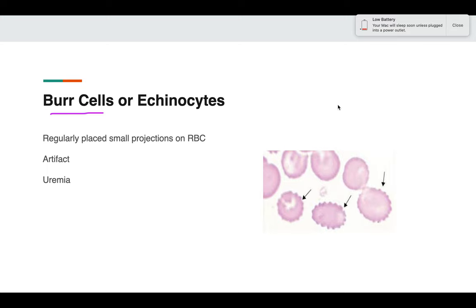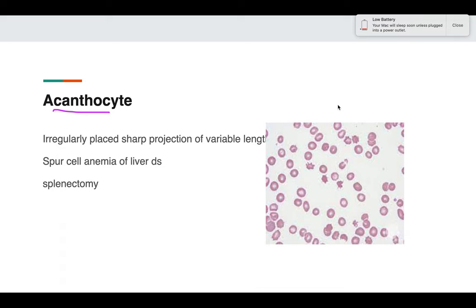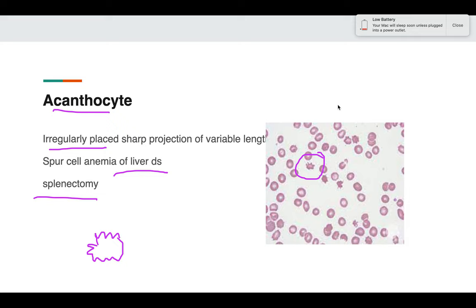Burr cells, or echinocytes, can be due to artifactual causes or uremia. They have regularly placed small projections over the RBCs. Acanthocytes are different: in burr cells the projections are regular and small, but in acanthocytes the projections are irregularly placed and sharp. Acanthocytes are seen in liver disease or splenectomy.